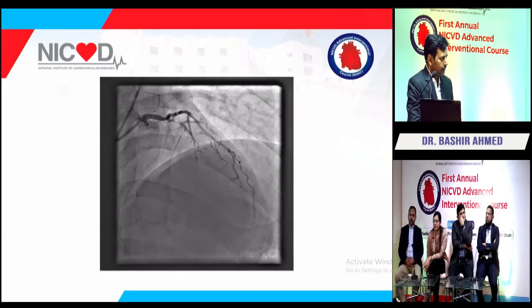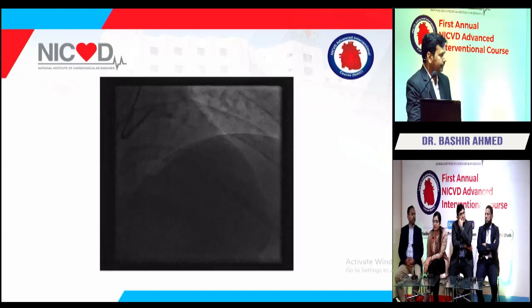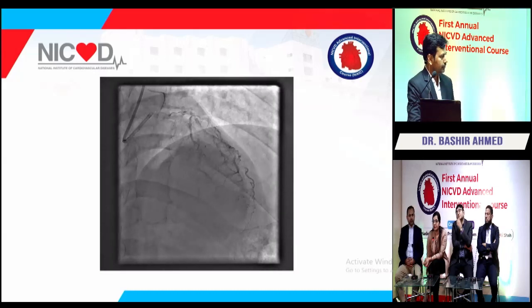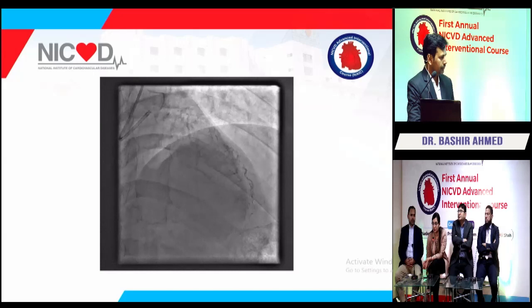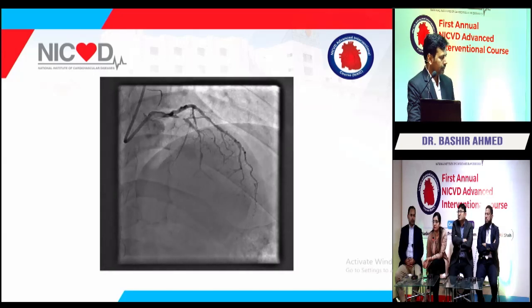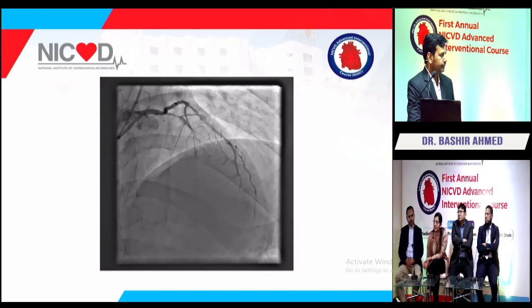Contraindications: there are certain absolute contraindications and some relative ones. So it's important to know the absolute contraindications at our fingertips. For a rota ablation procedure, it's important that you're able to get your wire down across the lesion. Only then can you perform the procedure. So if you fail to get your wire across, that's an absolute contraindication.